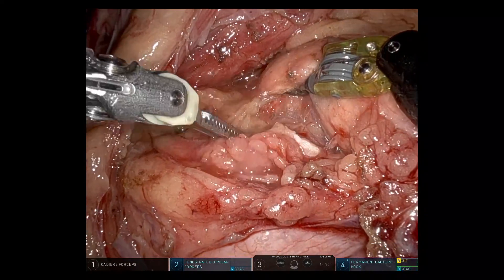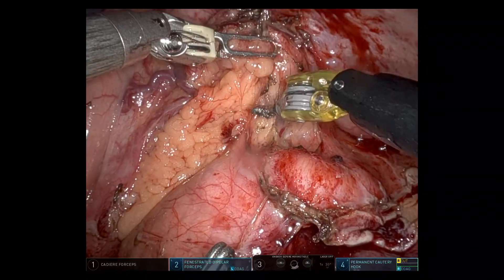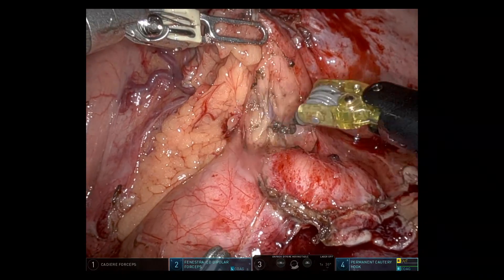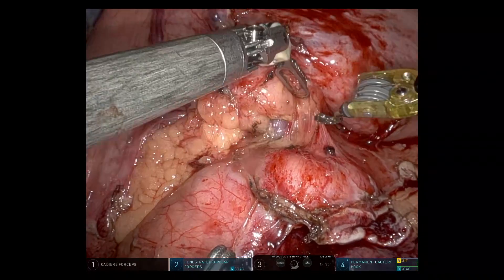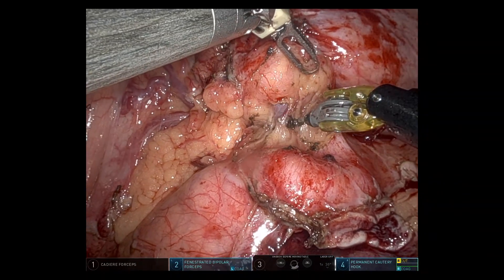Working medially and opening up the lower border of the pancreas to look for the SMV, which just became visible. Then working on the upper border, where you can start to see a dilated coronary vein draining into the splenic vein.